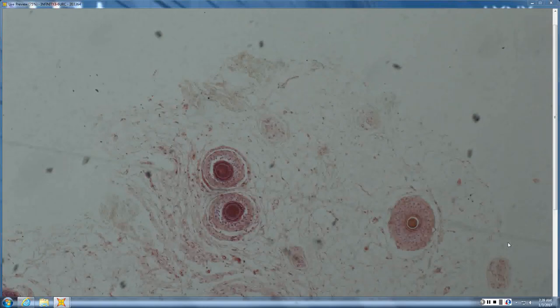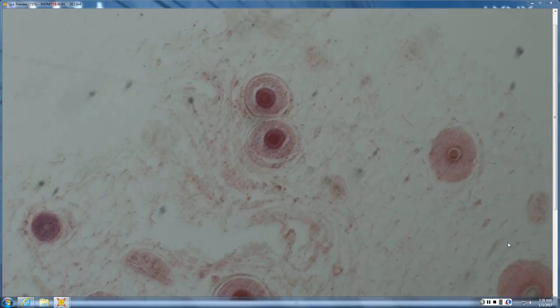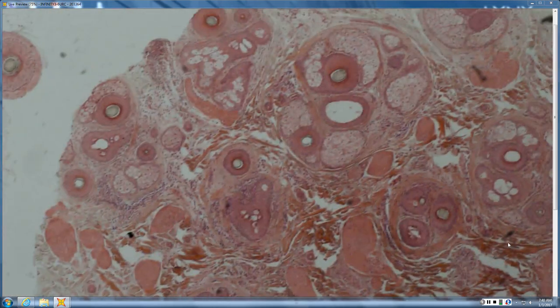Seeing what looks like a horizontal cross section here, and it looks like you have some areas of miniaturization. It doesn't look like there's a lot of inflammation anywhere, so it'd be non-inflammatory. Are they all miniaturized, or are some more miniaturized than others? Some are more miniaturized than others. And that would go most commonly with pattern alopecia, could also be alopecia areata, but AA and pattern are the two big ones that give you miniaturization. So there's at least a background of that, mm-hmm.